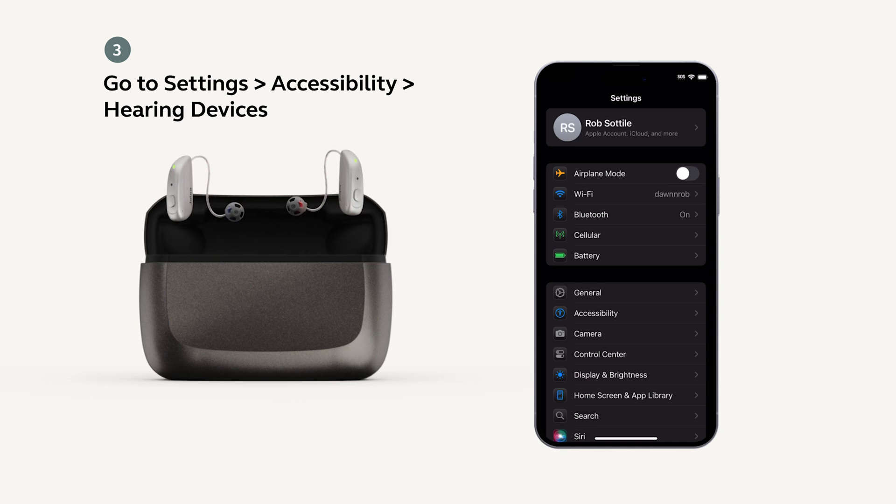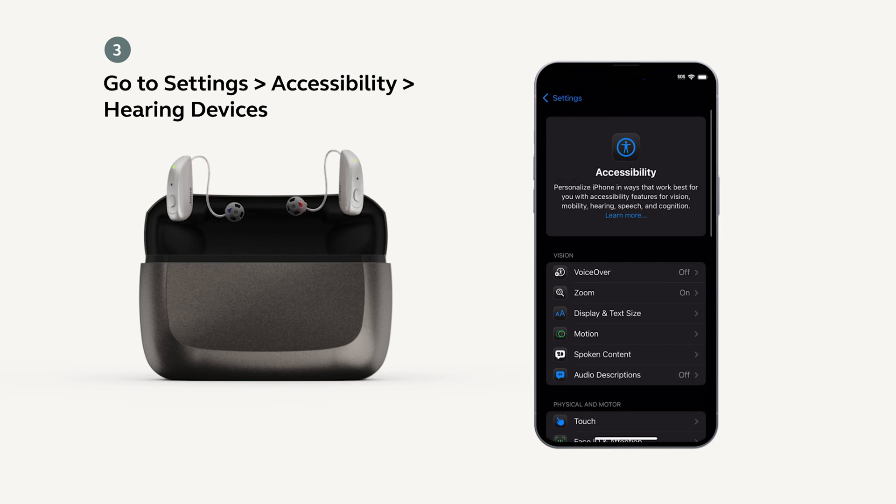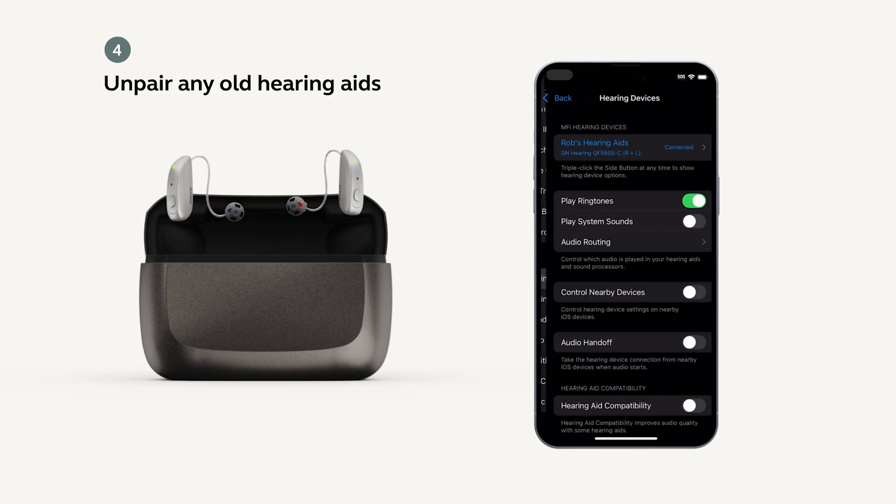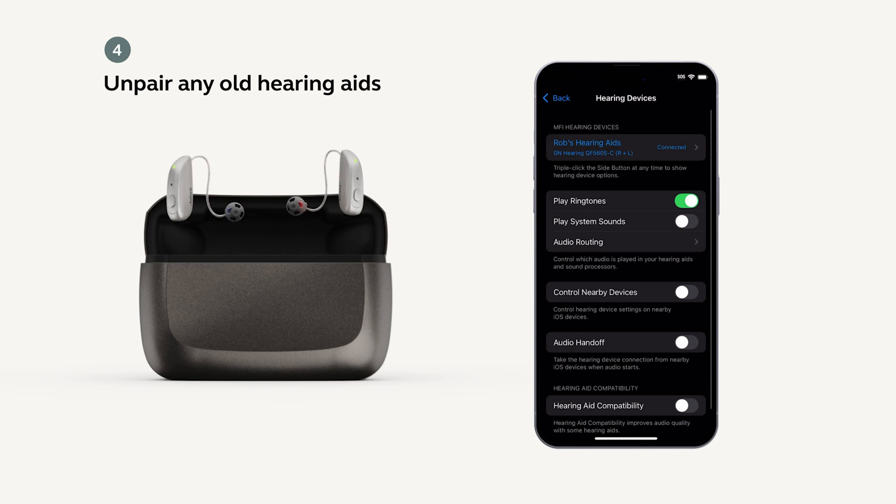Now, on your phone, go to Settings, then Accessibility, then look for Hearing Devices. If there are any other hearing devices listed there other than your Jabra Enhanced Select model, you will need to unpair them.